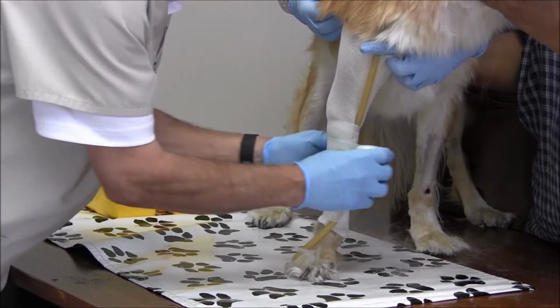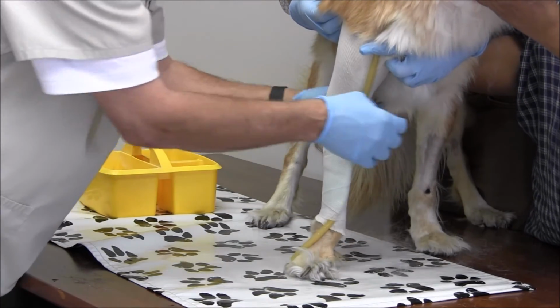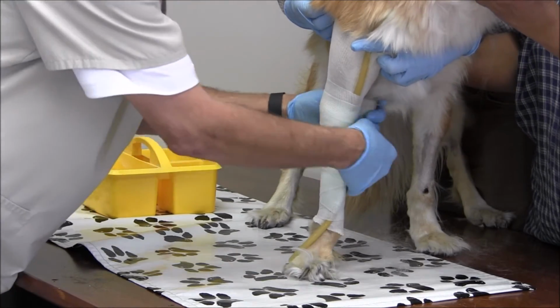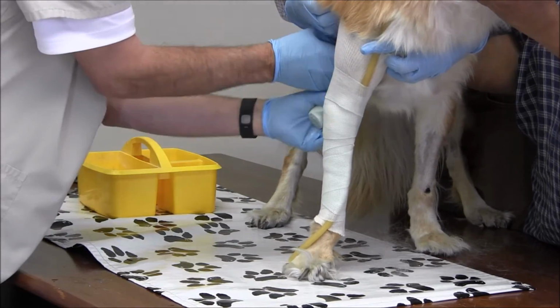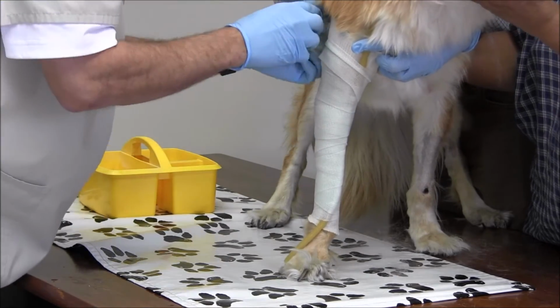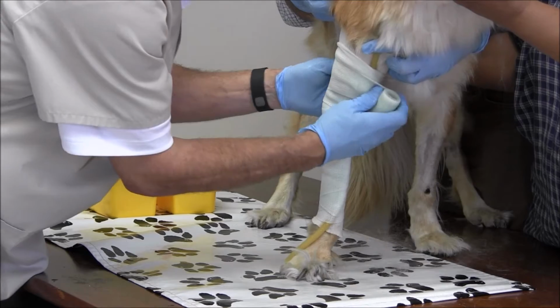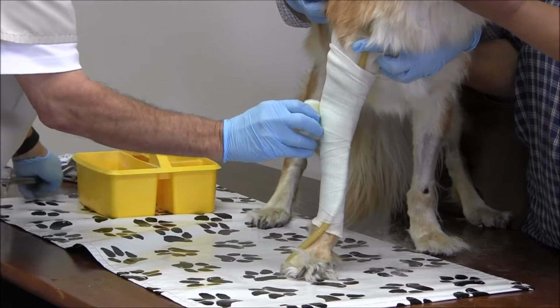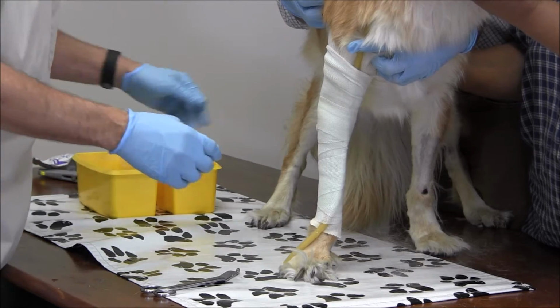And we're going to wrap only about 3 layers, and no more than that. Otherwise, the cast will get too thick. So we're going to wrap all the way up as high in the axilla as we can. And we got about 3 layers there, no more than that. And then any excess, we're going to just cut off and throw that away.